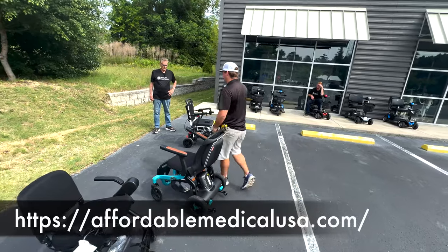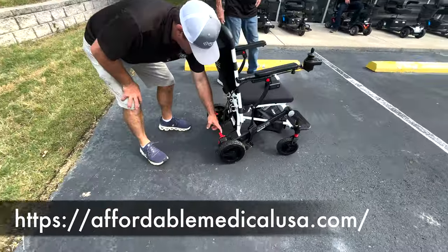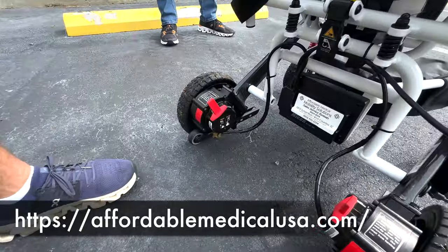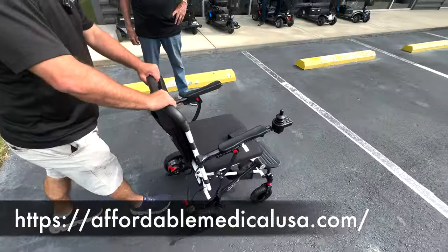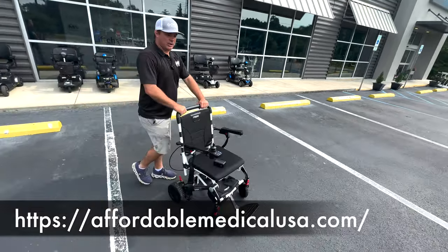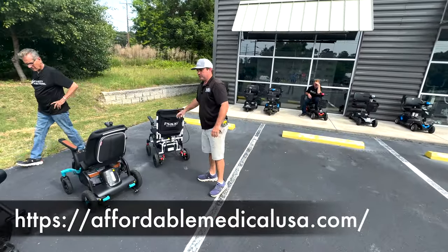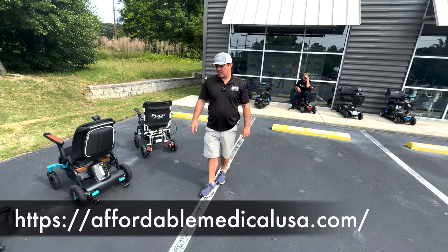And then we're going to get over here to the carbon. The same thing. You can use your foot if you're very light, but that's the push. And then you can push it. All of these have to be turned off to push. So you can use this as a transport chair, but once you flip it back, they can use it as a power wheelchair.